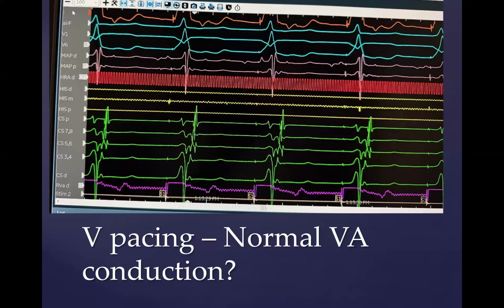And I do think that having either, it's interesting, at Texas Children's, the standard is that you get into the left atrium and then you pull the sheath back into the right atrium and only manipulate the catheter in the left atrium. I assume that's because they're afraid of thrombus, and also because there may be a belief that it allows you to manipulate the catheter a little more freely without having the long sheath there. Other people like myself, Barry, and I think most others like to have the sheath there because we think it creates a little bit more buttressing or support.